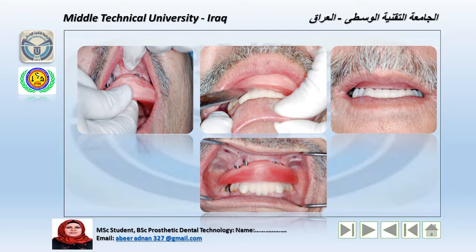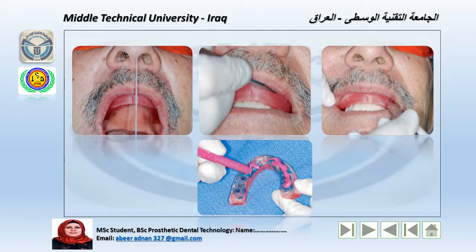The wax rim is modified in relation to the labial lip support. The incisal edge of the maxillary anterior teeth is determined with the wax rim. The complete wax rim for the anterior teeth and occlusal vertical dimension is recorded. The midline of restoration is determined using dental floss.